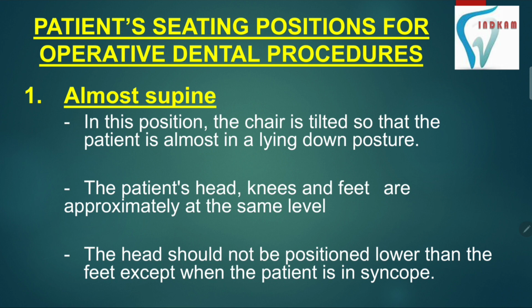In this position, the chair is tilted so that the patient is almost in a lying down posture and the patient's head, knees and feet are approximately at the same level, and the head should not be positioned lower than the feet except when the patient is in syncope. So we have to keep it in mind that head position should never go lower than the feet.